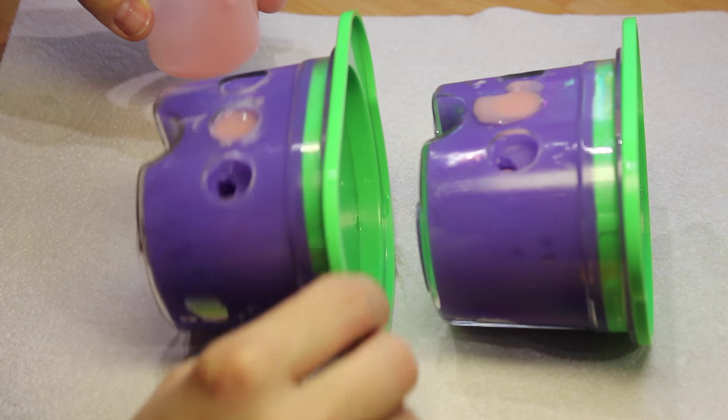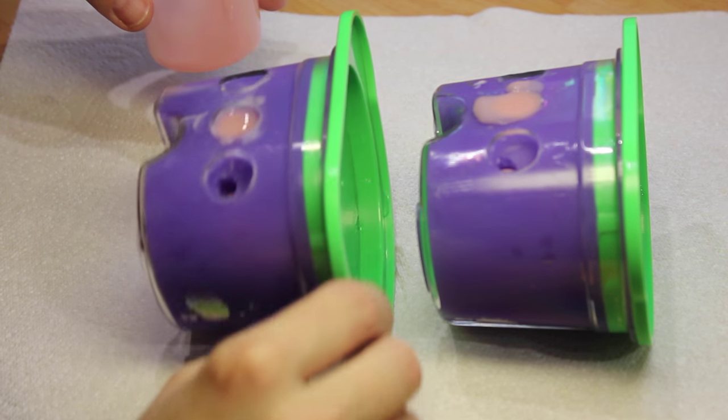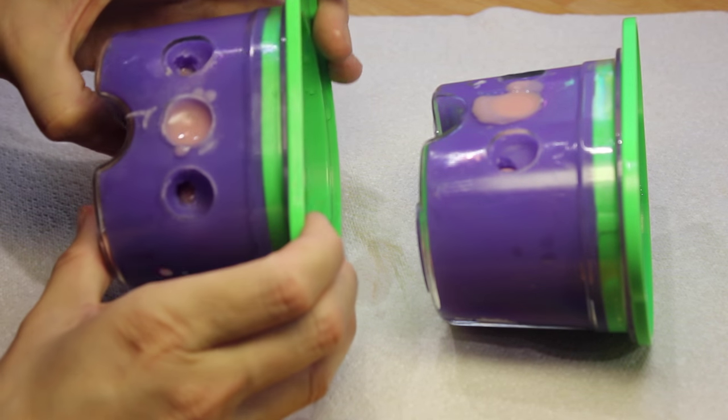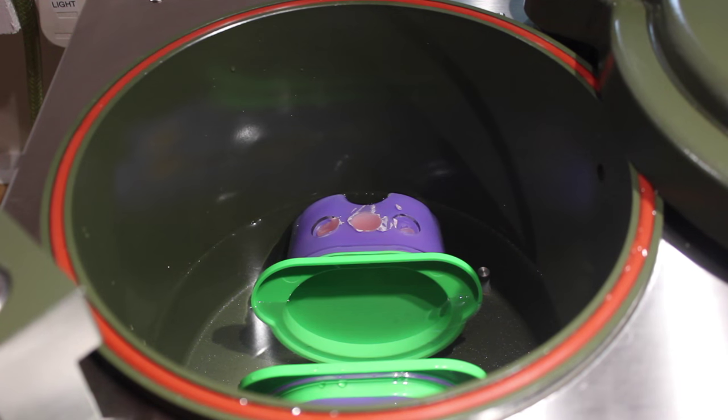A slight rock helps to get rid of any air bubbles. Place your poured flasks into your hydro flask — don't submerge them — but try to get the water level about the same height as the back of the flask. Then process for about 20 minutes at 40 to 50 degrees Celsius water at about 5 to 6 bar pressure.